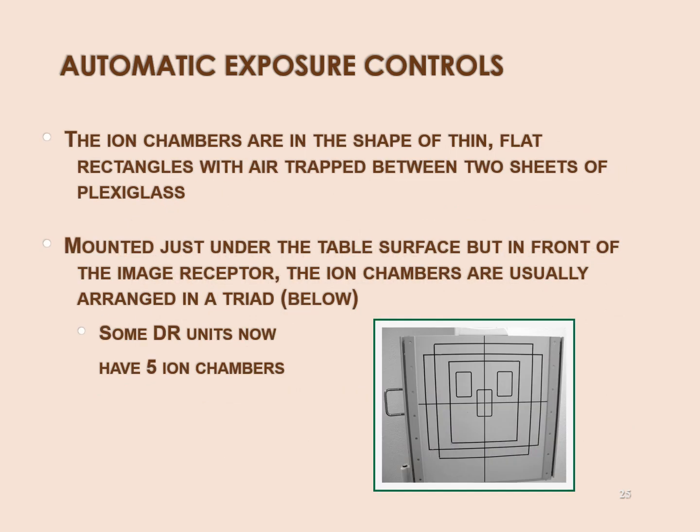All right, so ion chambers, they're thin, flat rectangles. Typically, they're made out of like clamshell plastic. You know, you've ordered something or bought something in the store that the device was wrapped in. The best is a pair of scissors that they wrap in, because you need a pair of scissors in order to open the clamshell packaging. That's the ultimate irony, selling someone a pair of scissors that is wrapped in clamshell plastic.